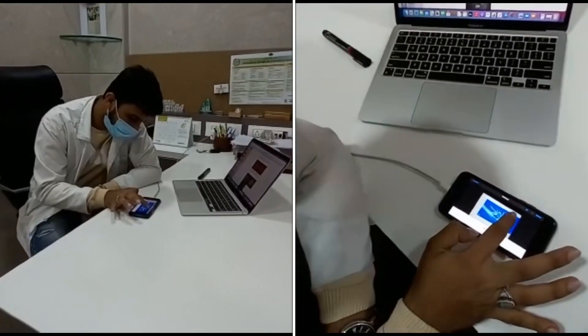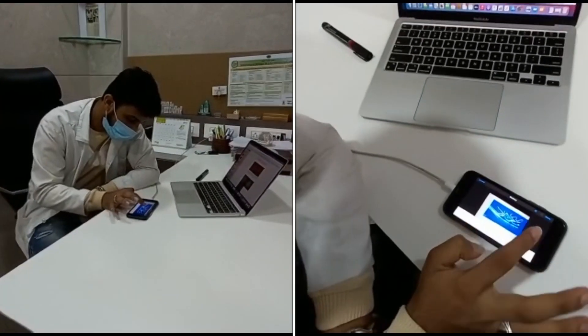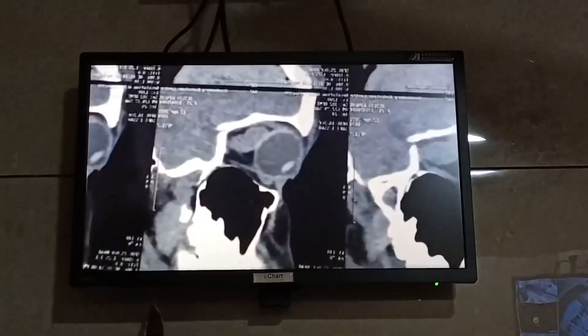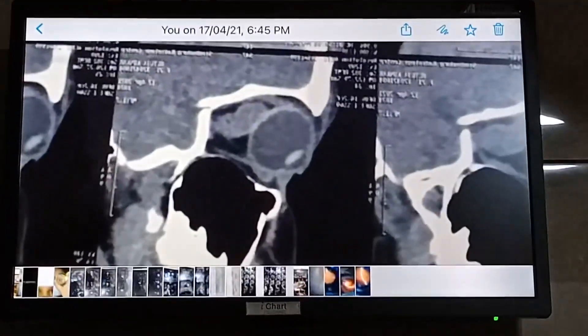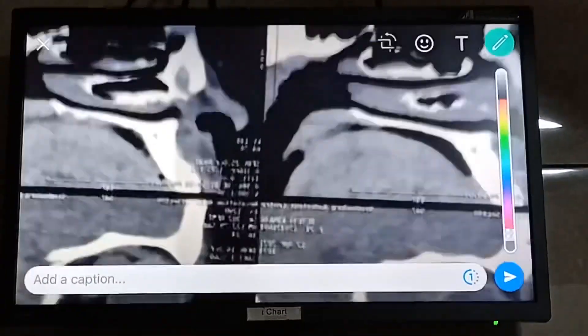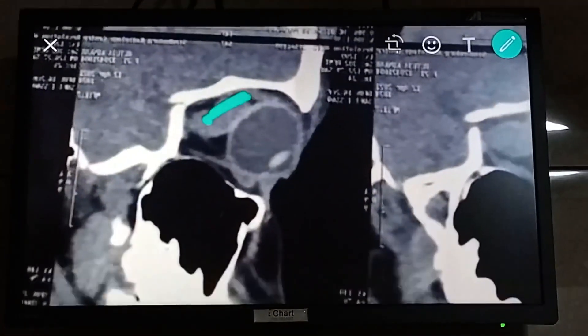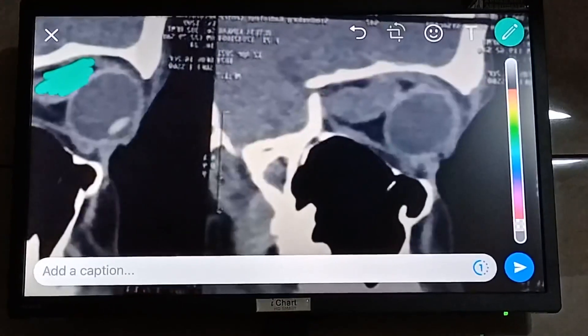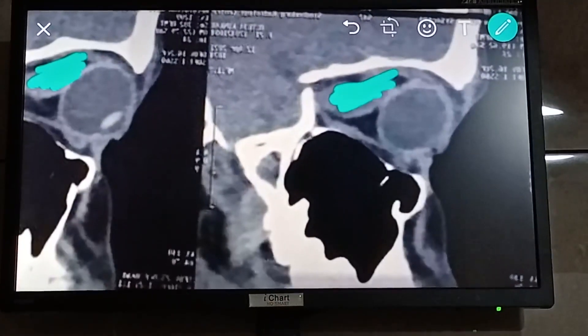You can even use non-ophthalmic investigations like CT or MRI — like in this case, a zoomed image of an optic nerve glioma, beautifully marked and easily explained.